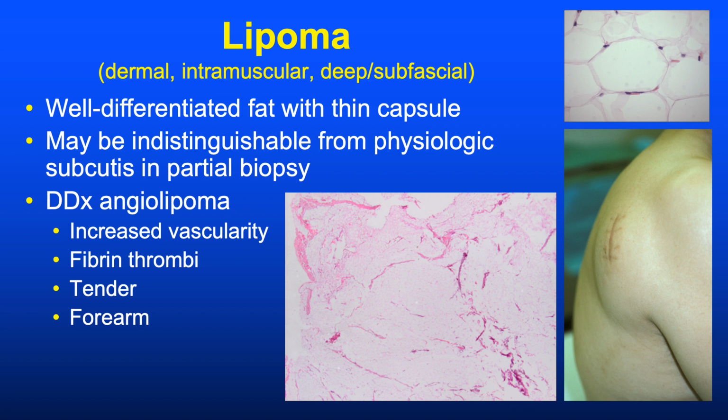Almost as incredibly common and comparably annoying to the skin tag is the lipoma. This image on the lower right was the largest lipoma that I personally removed in my past life as a dermatologic surgeon, but now as a pathologist I see these multiple times a day, and lipomas are characterized by lobules of well-differentiated fat, typically centered in the subcutis, although they can sometimes be deeper or more superficial, and the individual tumor cells look like fully differentiated adipocytes.